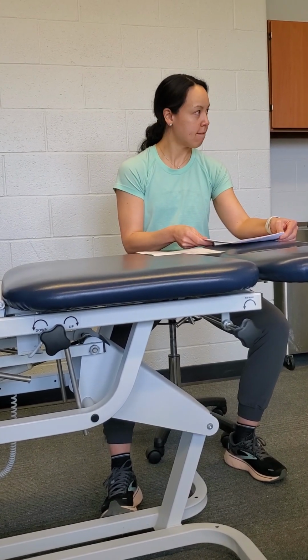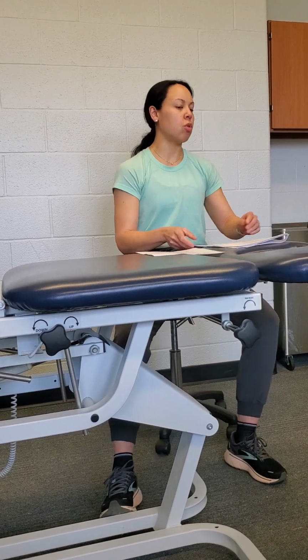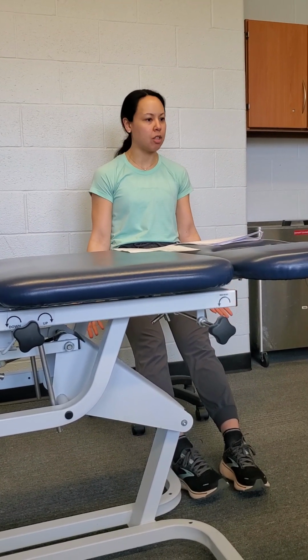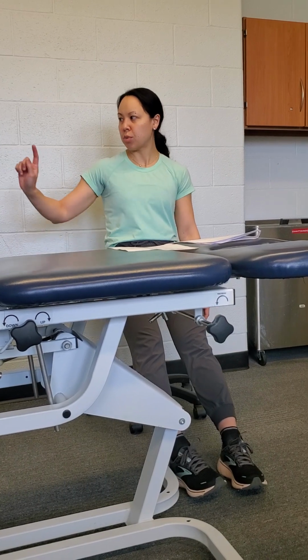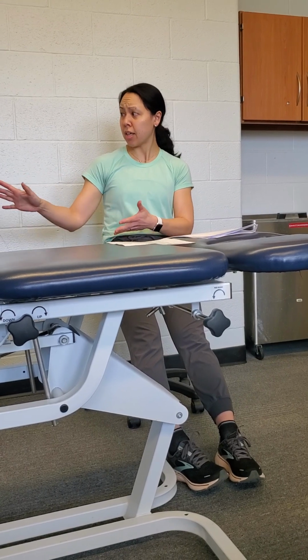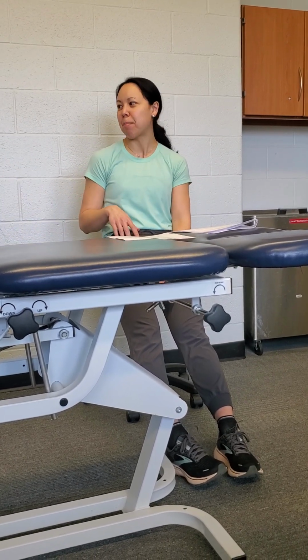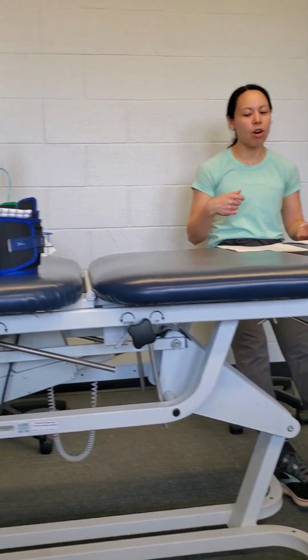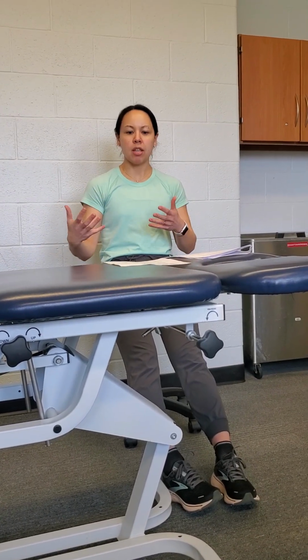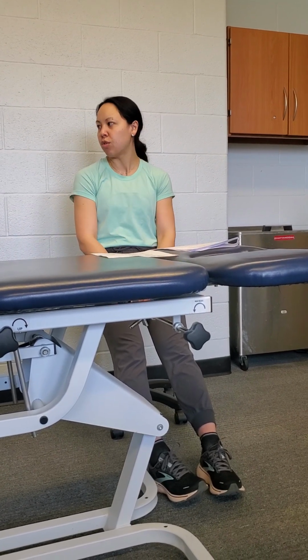Did you mention if that was done in the position of the exercise? No. Regardless of what exercise they're going to do, they have to lie down and just completely relax. They shouldn't be talking. They shouldn't be doing anything. And that's when you would hit the blue button. That's the first thing you're going to do, calculate the Doppler. Once that is calculated and there are no error codes, which can sometimes happen if the cuff isn't on properly or the patient was moving, and we'll talk about strategies to get around that, then they can get up, move to a machine, a seated position, standing, whatever you want them to do for the exercise after that.